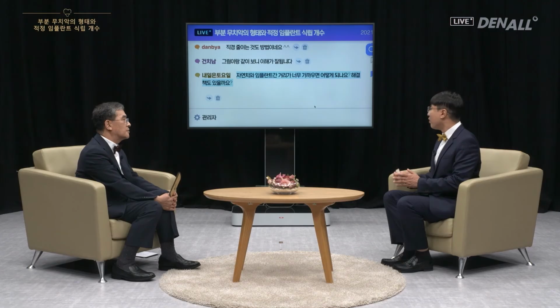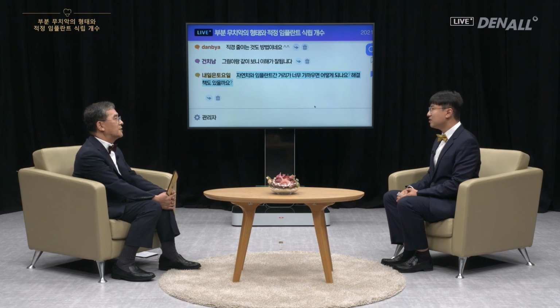The key is how thin you can get the abutment to be, and how to secure soft tissue between implant and natural teeth. I believe there is limitation in 2-piece abutment, and if you want to secure more space, I prefer rigid abutment, 1-piece abutment, or solid abutment.